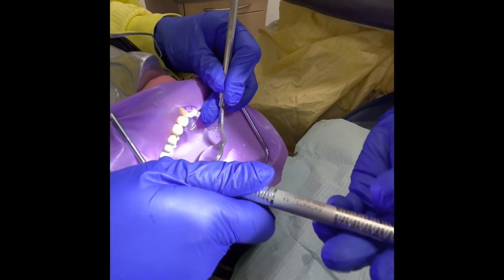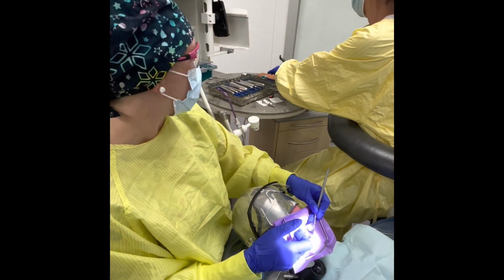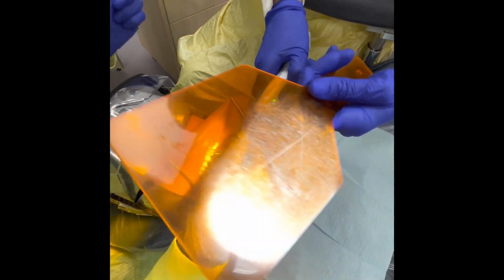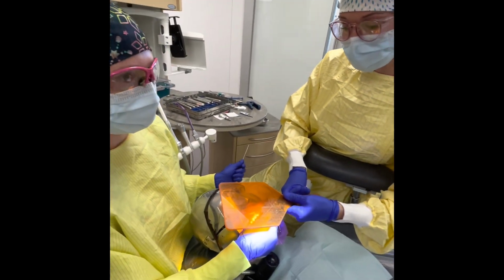Okay, thank you, Stacy, and we can cure that, please. The flowable composite is cured for 20 seconds. So I will have to make sure I change my setting to 20. Amanda's going to help me again. I'm going to protect both of us, and we will cure for 20 seconds.